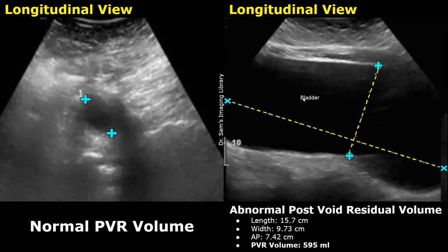Note that the AP measurement can also be measured in the longitudinal plane instead of the transverse plane. It is measured in a similar manner by placing the calipers at the anterior and posterior walls of the bladder.